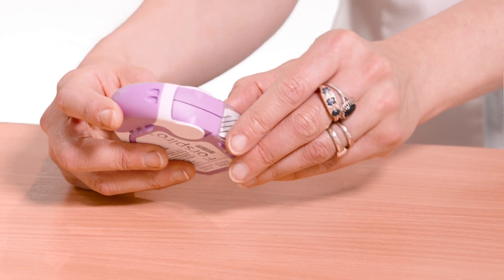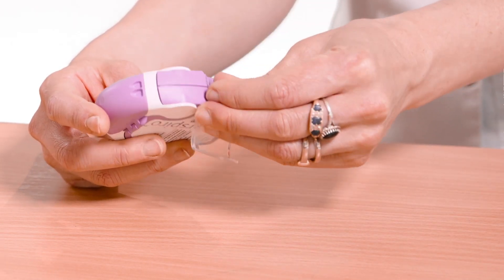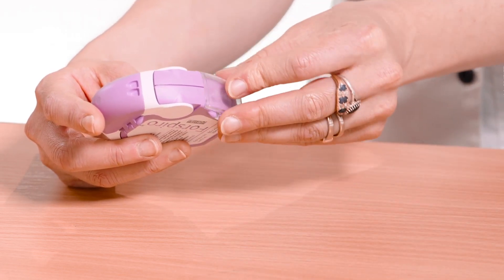Before each inhaler use, open the transparent side chamber door. Carefully tear away the foil strip. Close the side chamber door and dispose of the foil strip.